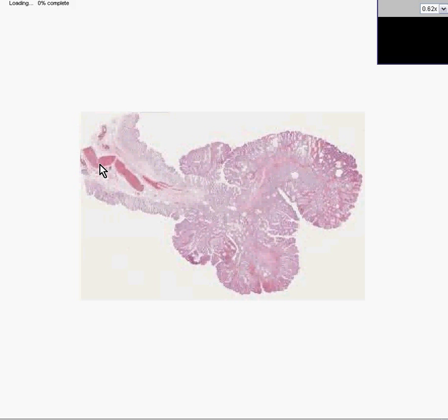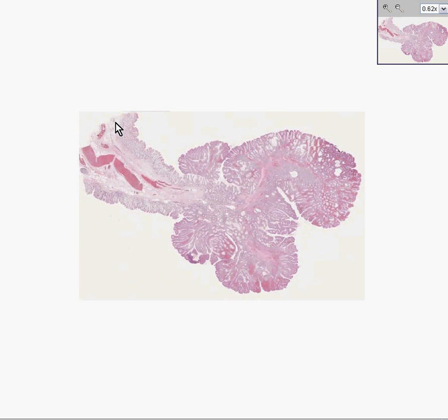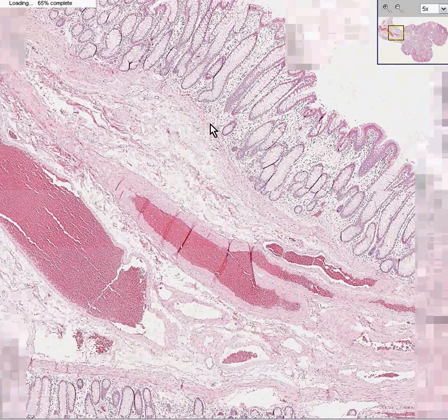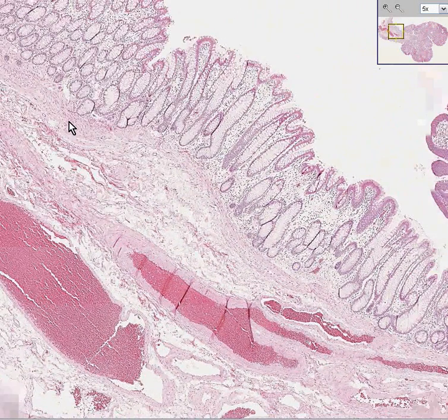The pathologist cuts it and processes it. And you can see once again this nice stalk rimmed by normal mucosa, having normal vascular submucosa in the core of the stalk. Notice once again that here is a nice uniform strip of muscularis mucosa.